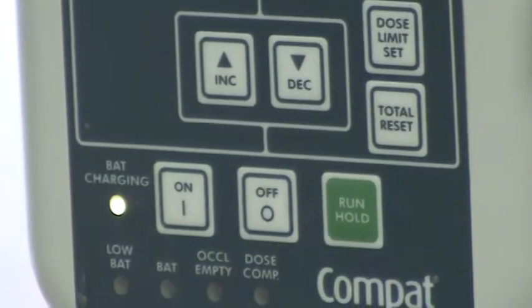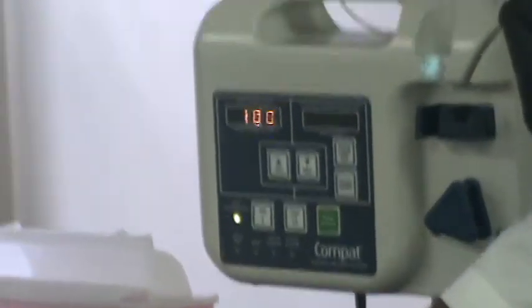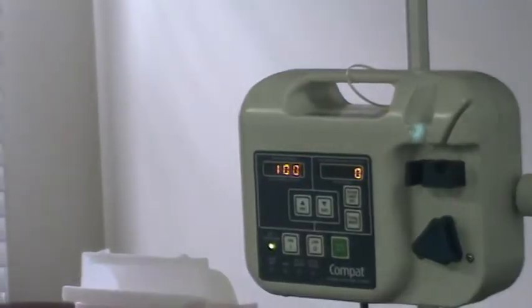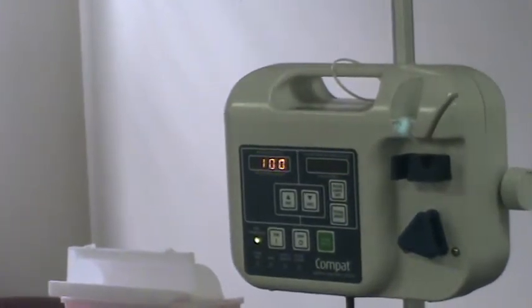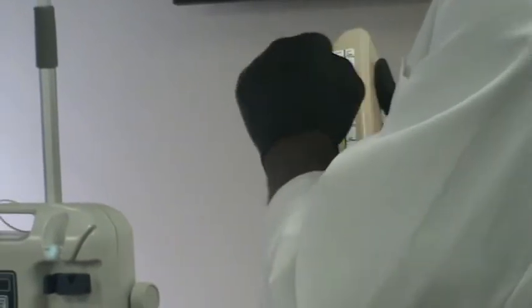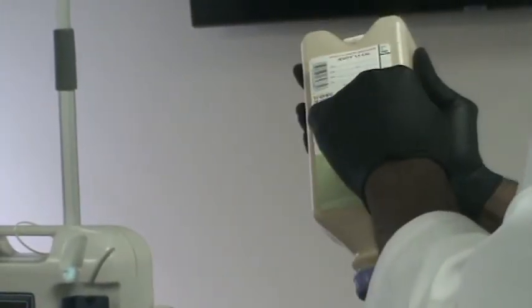So now, again, before you start any feeding, you're going to do what? Flush. So let's assume we flush. You're going to get your bottle and your connection tube. You're going to label the bottle: put the name, room number if any, the date, start time, and the rate per hour.